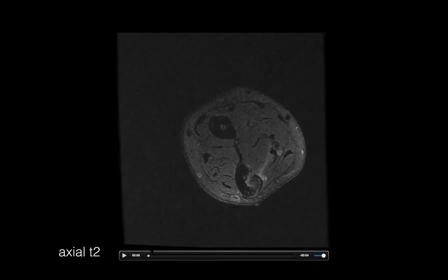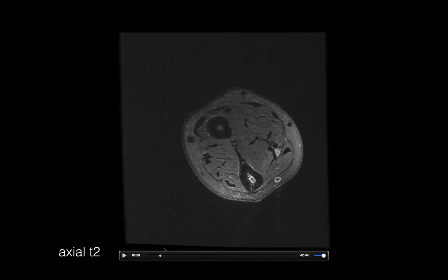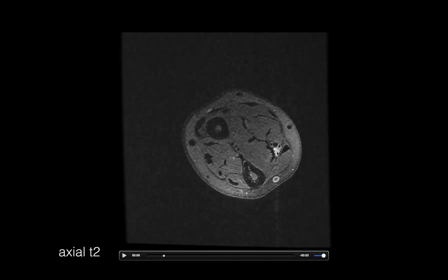So you can see that in this case, there's a neuritis. That nerve got irritated by the fracture, probably got traumatized. Now the nerve is enlarged and edematous. And that accounts for the tingling that's very prototypical in its location on the fourth and fifth digits. That's from your ulnar nerve. So usually you have a radial nerve, a median nerve, and an ulnar nerve, three nerves that go into the hand. And in this case, the ulnar nerve got damaged.